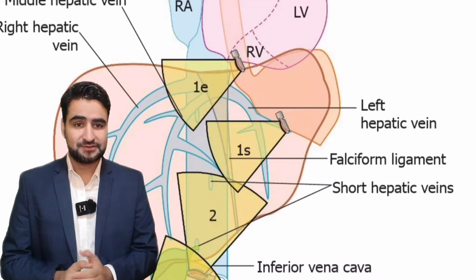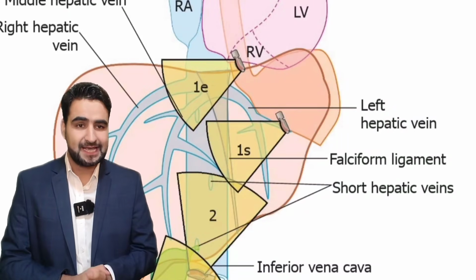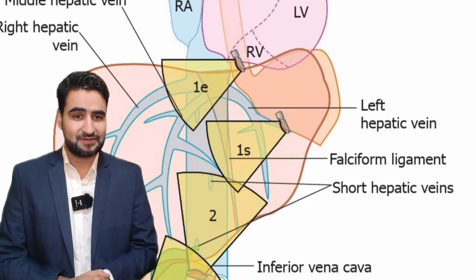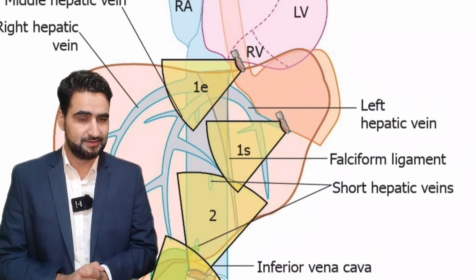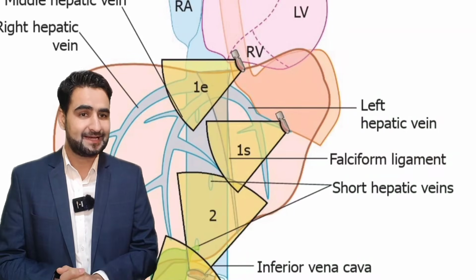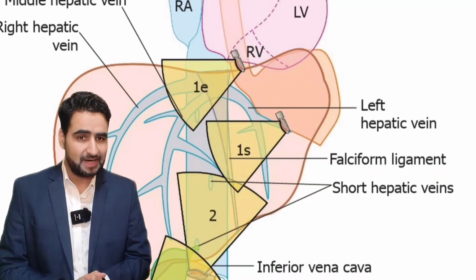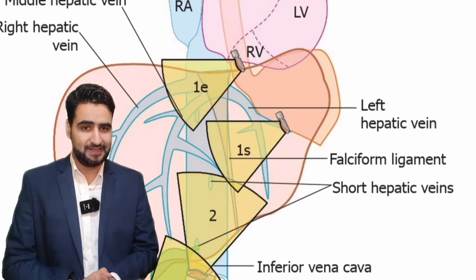Station 1 refers to the level of the abdominal part of the esophagus just below the gastroesophageal junction. From this point, the ultrasound beam gives us an excellent view of the left lobe of the liver, especially segments 2 and 3, and their relationship with the portal vein branches. Let's go through the imaging step by step using key frames.